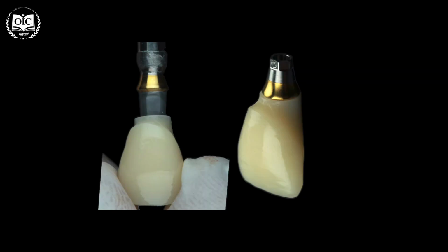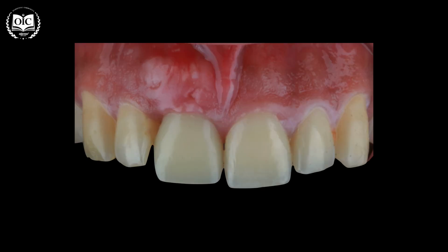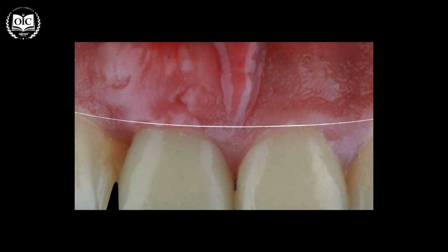Only 1 week, and we prepare a better one with a polished contour and a subcritical contour that's concave and healthy around the tissues to help in the healing of the tissues. We load it after maybe 5 days after the surgery, then it heals beautifully after 2 more months. The more we leave it, the more it matures, and we just sometimes do some fine touches with laser or with electrosurgery to fix some scars around the gingiva.